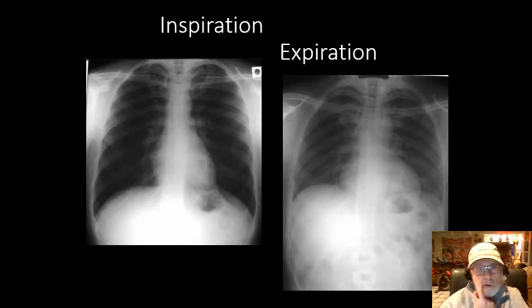Now, I mentioned before about inspiration versus expiration. If you've had a chest x-ray, what you realize is you stand in front of the x-ray plate, either a screen where they're capturing an electronic image for digital x-rays, or in the old situation when they had film, and you'd be standing there usually with your chest against that. And the reason why is, by putting your chest against the screen or against the film, things that are further away from the film get magnified a little bit more.